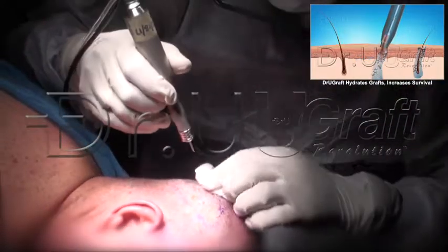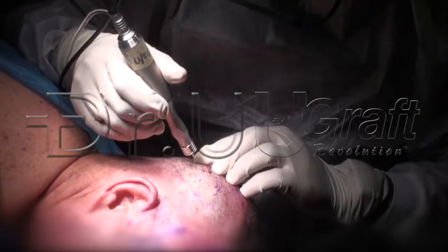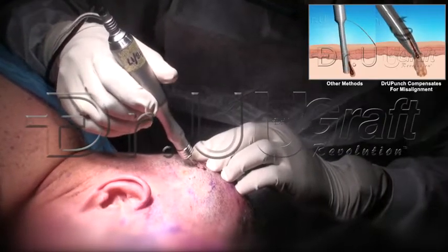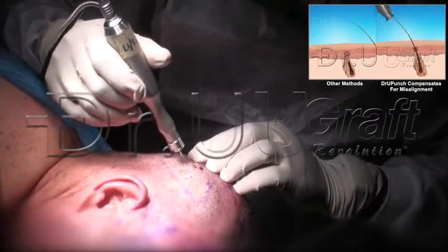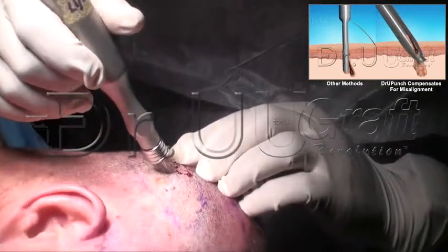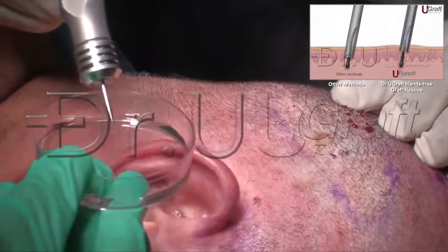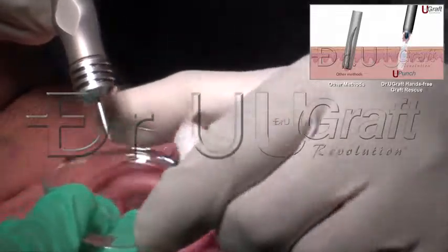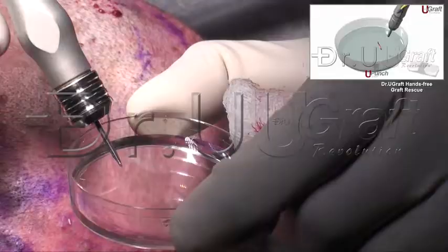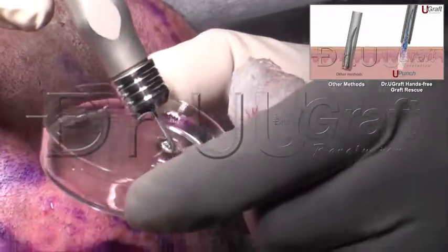You don't need a PhD. You don't need a doctorate in FUE to use the intelligent punch. You just aim, cycle the hair, and release. And you can see with that method — the graft is there, intact.